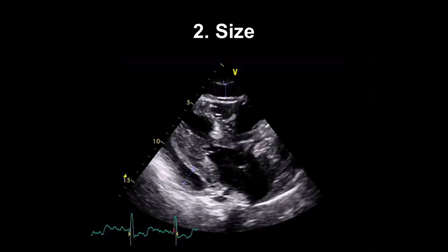We want to think about the size of the effusion. The hemodynamic effect is not directly related to size — a small, quickly accumulating effusion can be hemodynamically worse than a larger chronic one. However, once you've found a pericardial effusion you'll likely be re-scanning the patient to show whether it's getting worse or better, so measurements are useful to compare. Less than one centimetre is a small effusion, one to two centimetres is moderate, and more than two centimetres is large. In this view the effusion looks moderate.